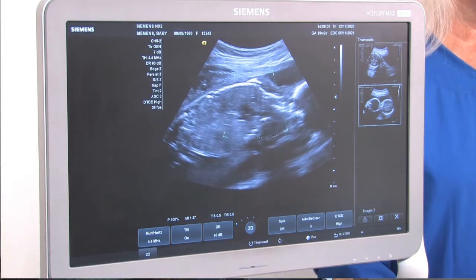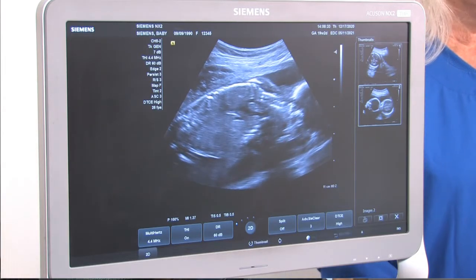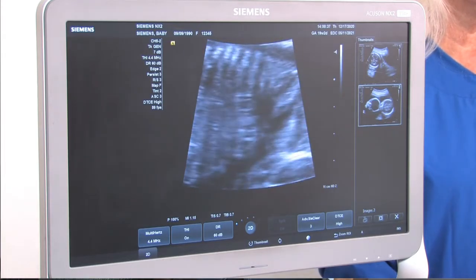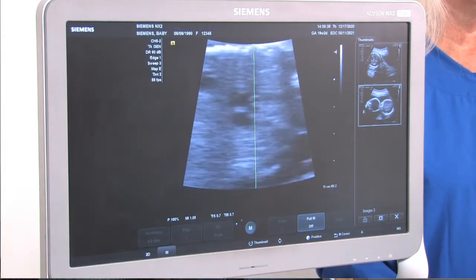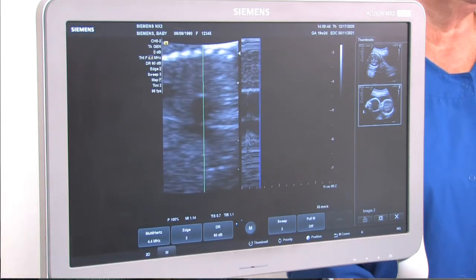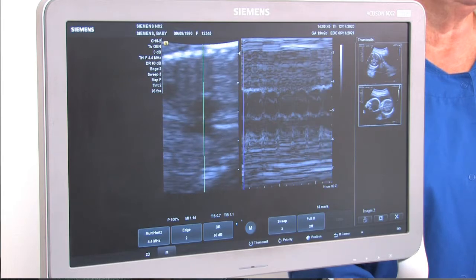So with ultrasound, I've been doing this for many years. I've trained myself when I see something, I take that measurement because that baby might move out of my way and I might have a hard time finding it down the road. So I'm going to do the heartbeat on baby A right away.